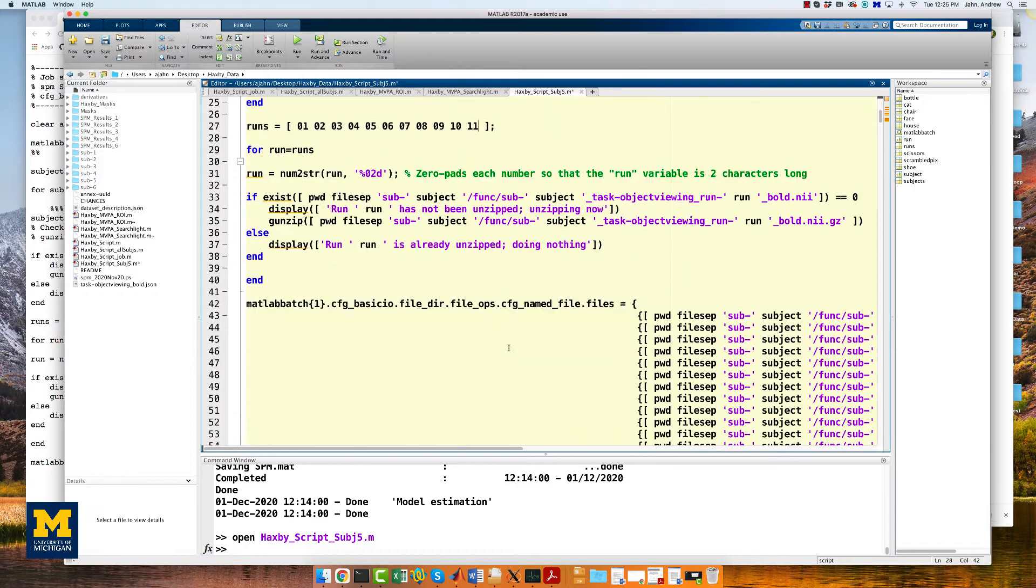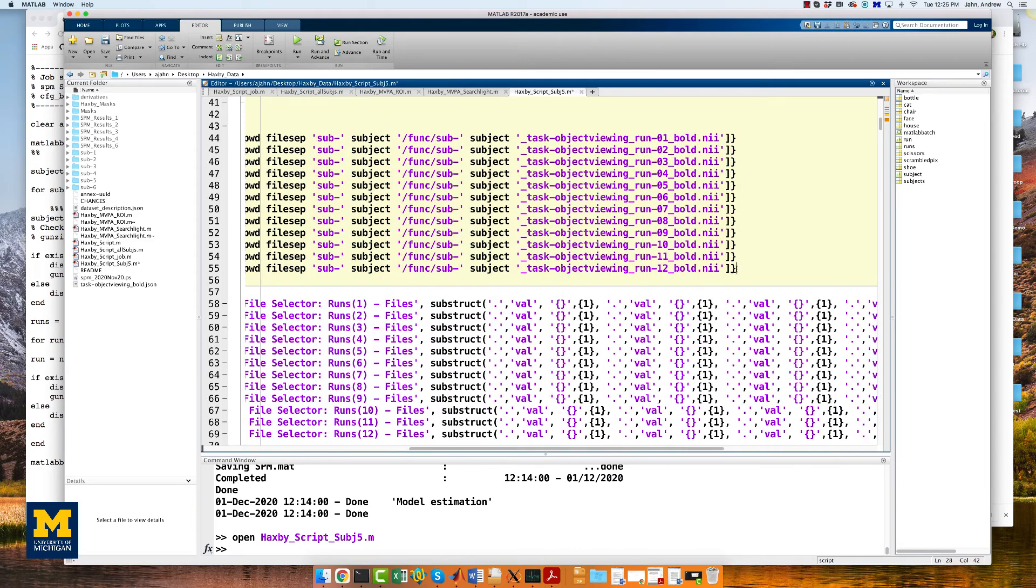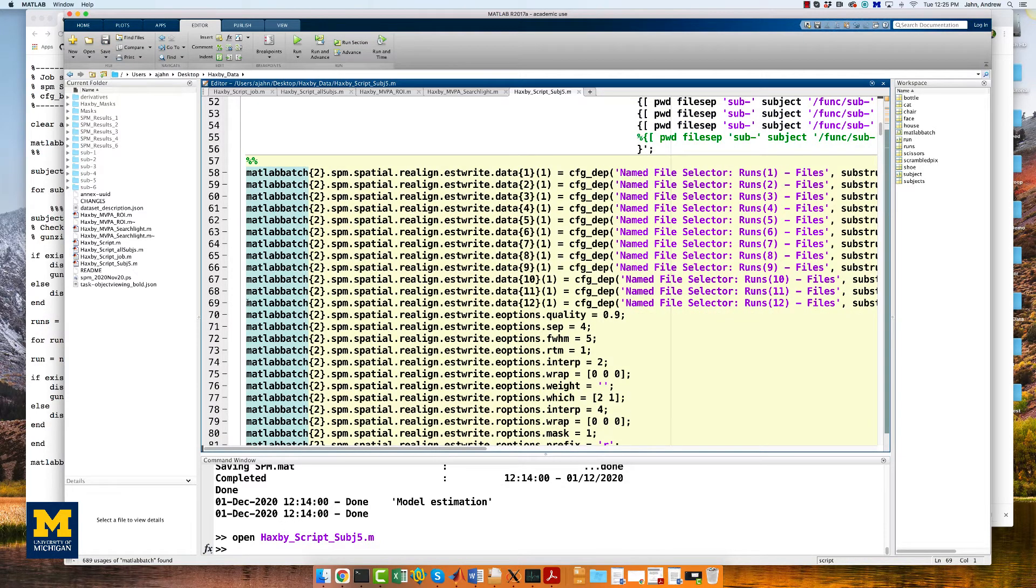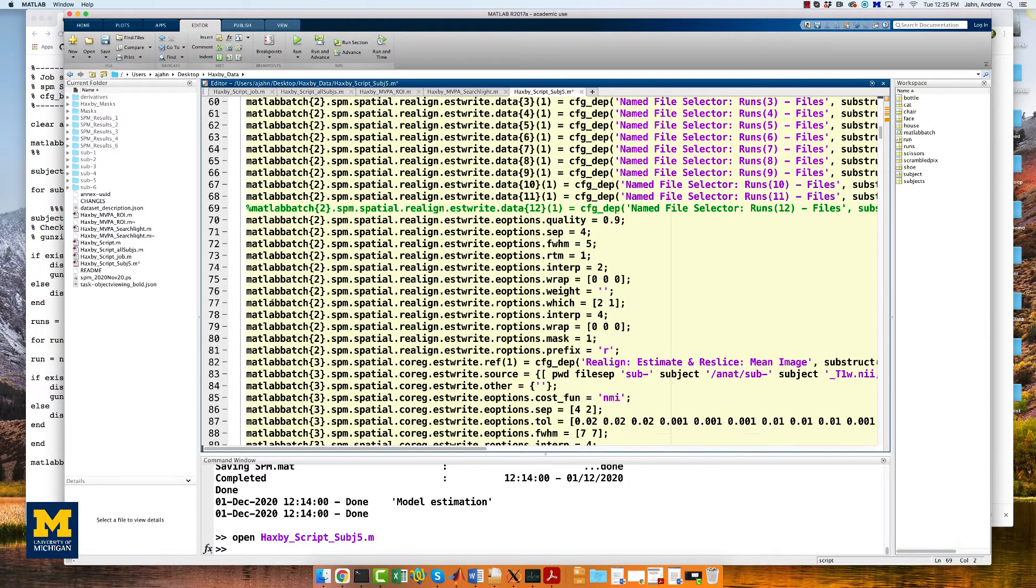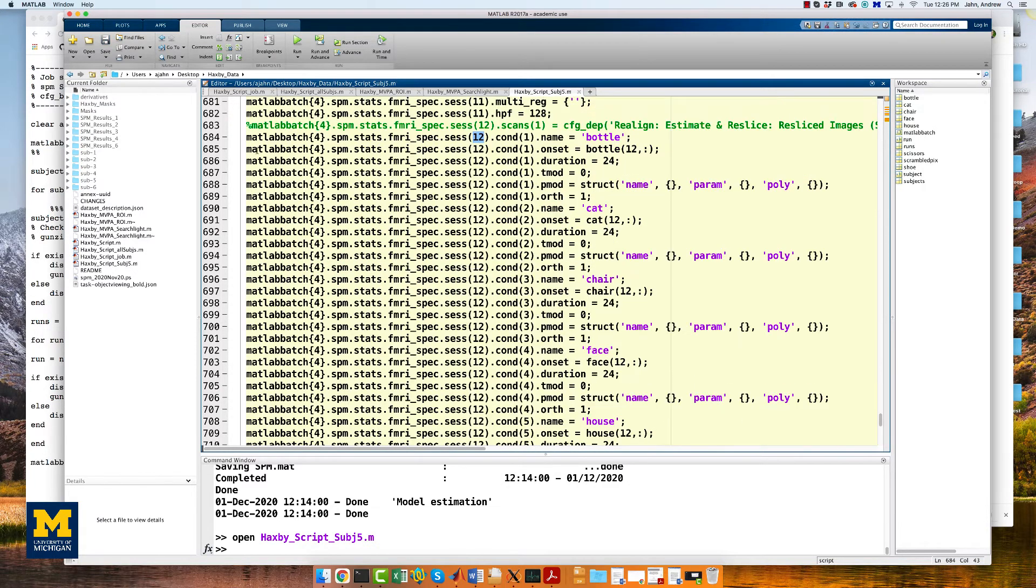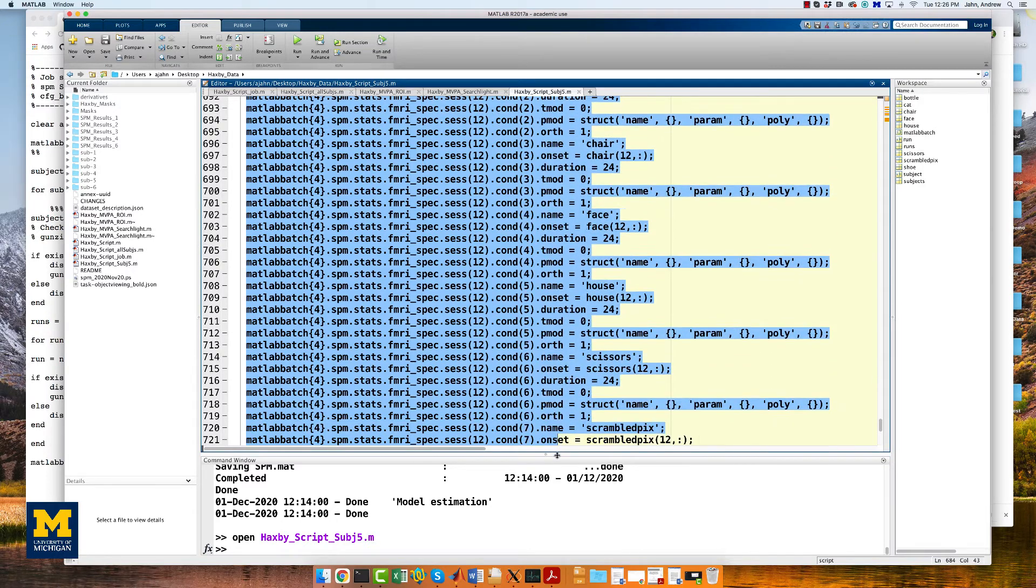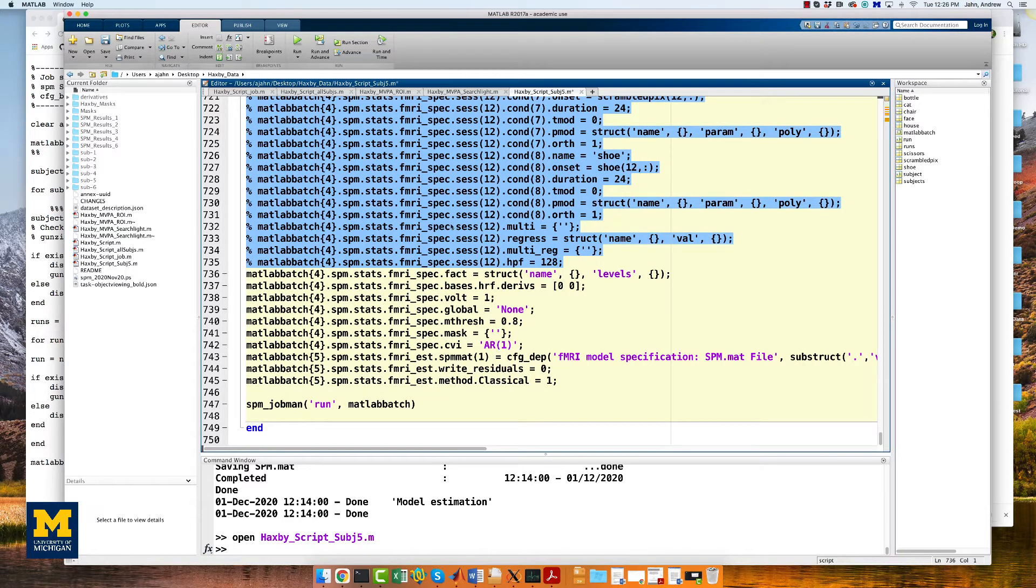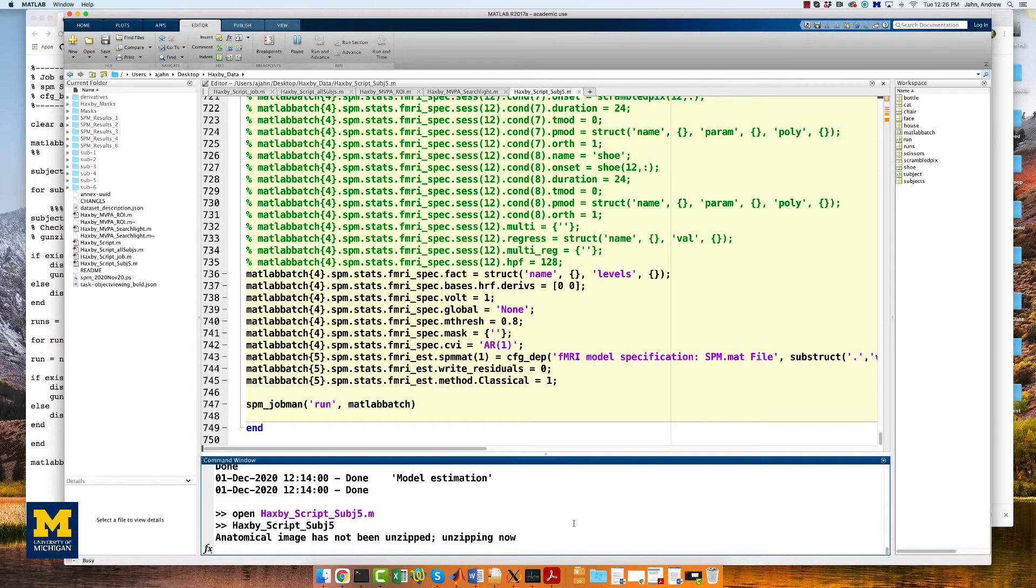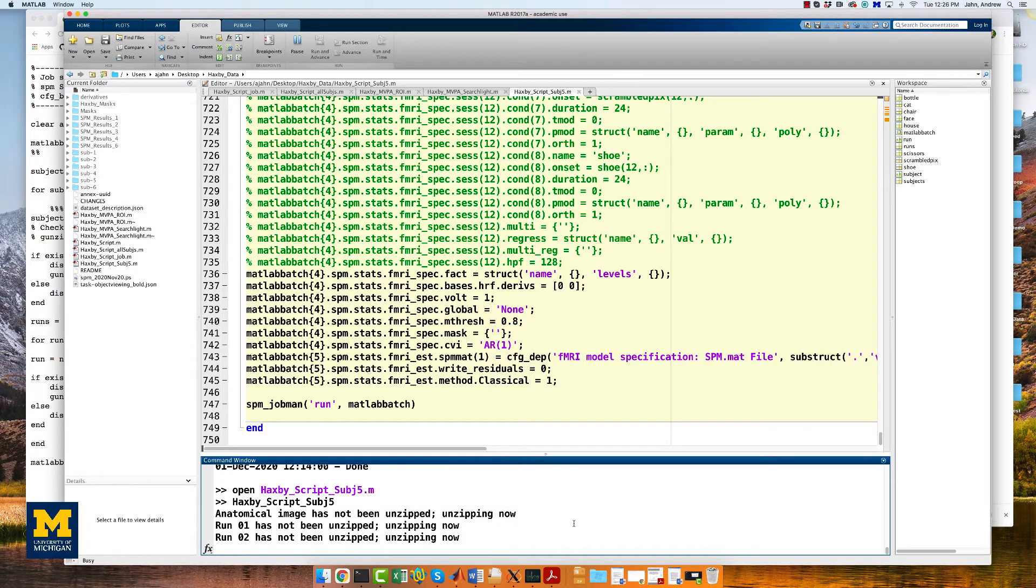And we're also going to remove run 12, which was not included with this particular subject. That means we need to comment out any other line that refers to run 12, such as this line that loads run 12 of the bold files. Again, we find another line here that contains a reference to the 12th run. If we scroll down to the section that specifies the model, you will find an entire block of code dedicated to filling in the timings for run 12. Highlight that entire block that refers to run 12 and comment it out. Then, run the script by typing Haxby script subject 5 and then pressing enter. Again I'm going to fade out and come back when it's finished.